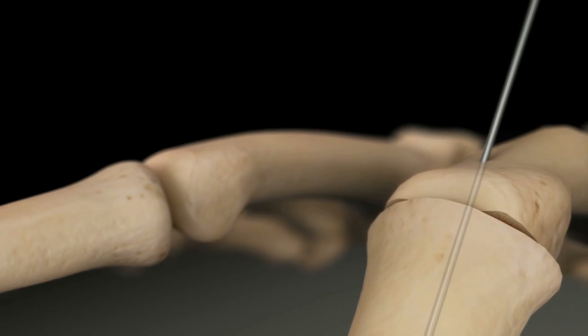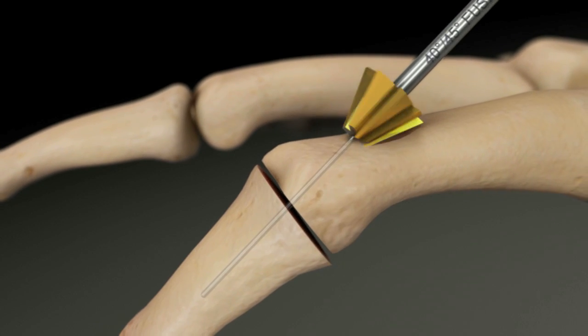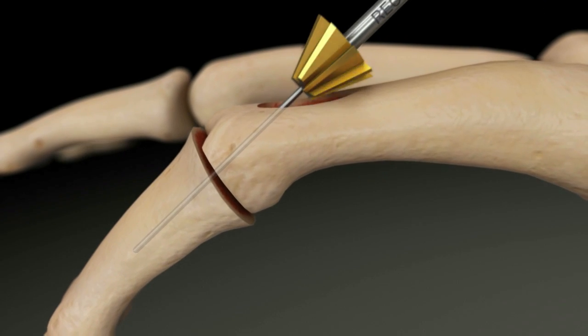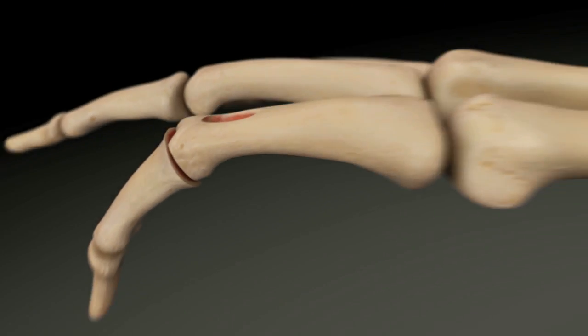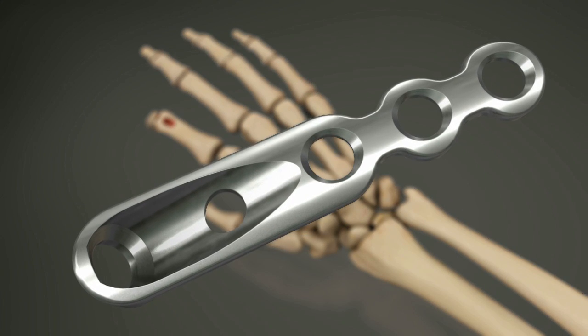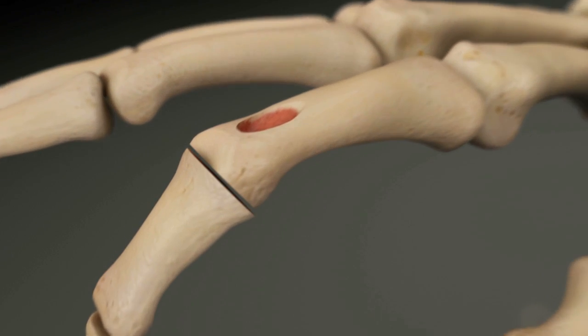With the reamer marked for your fusion angle, ream over the K-wire until the distal tip surface is cutting the bone. The low profile plate has rounded edges and is designed to sit in the recess of the bone created by the reamer.